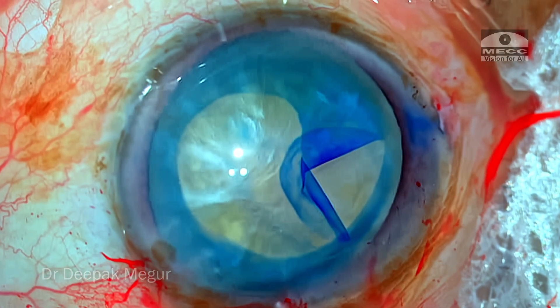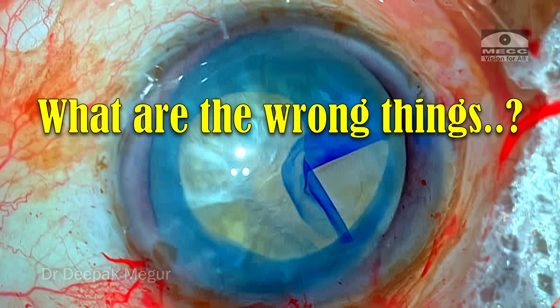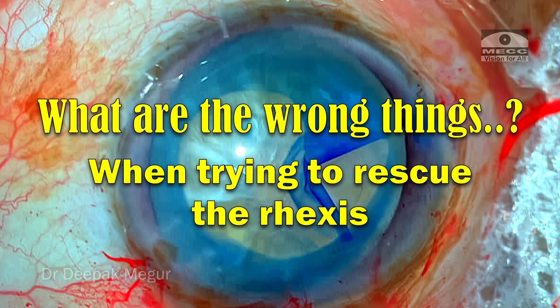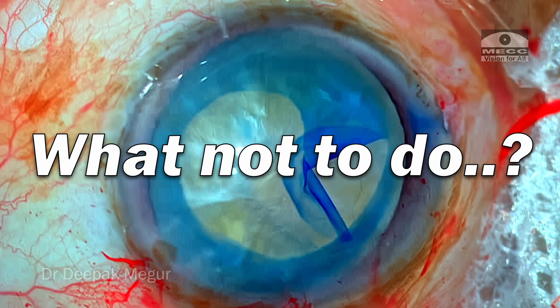Hi, this is an unusual video. I'm going to share with you what are the wrong things one can do when you're trying to save a rhexis. In other words, these are things which are not to be done when you're trying to save a rhexis from running off.